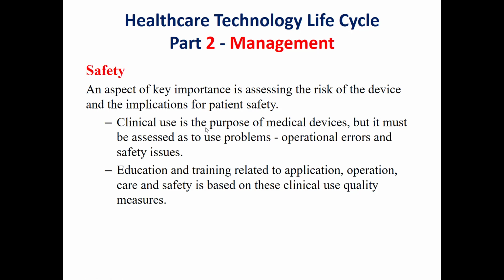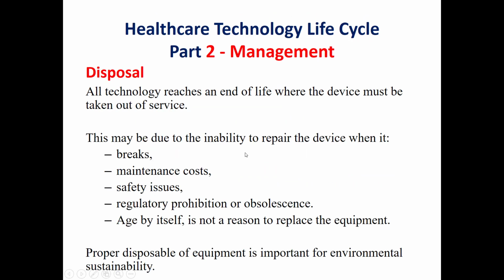And another point is to ensure that operational errors and safety issues are fixed prior to there being a risk to the patient, or even the operator or the user of this medical equipment. In case of having an error or a safety issue, an action will be taken to solve this problem. Finally, the disposal of the medical device.